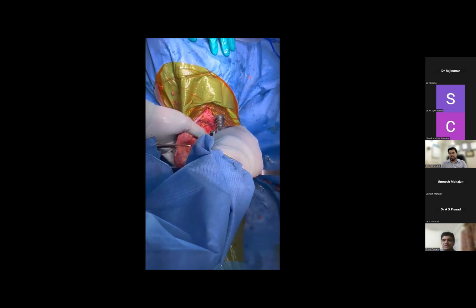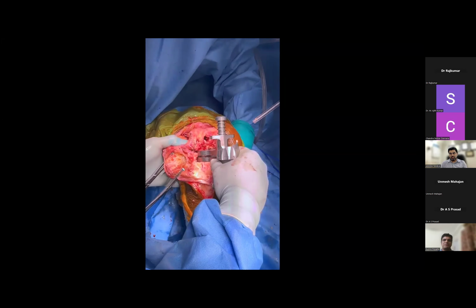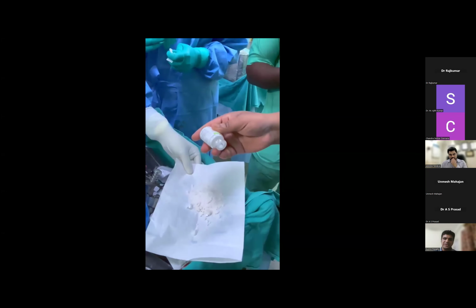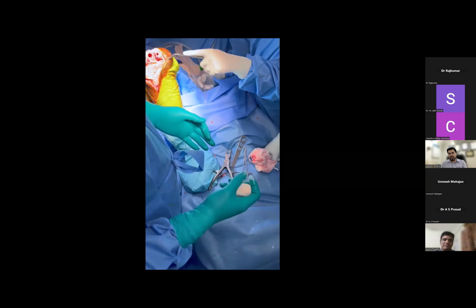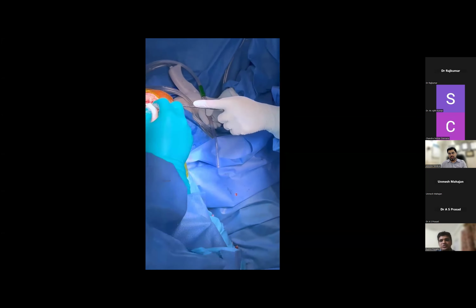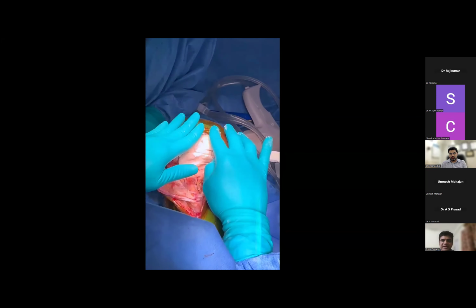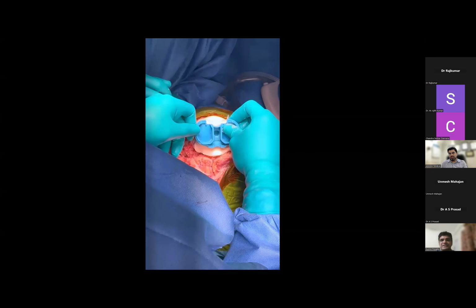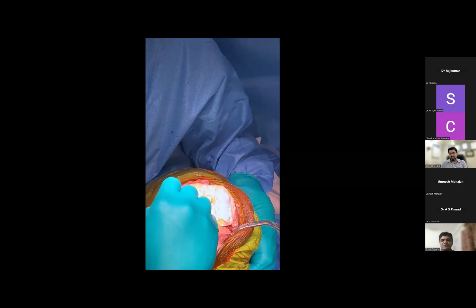So this is the extension gap. Here it was found to be 13 mm, and in flexion also we noticed that it is 13 mm. So probably it will be a well-balanced spacer that we are going to make. Then you should redrape and add vancomycin to the bone cement. We normally use 4 gram of vancomycin to 40 gram of bone cement, and normally 2 packs of bone cement are minimally required. We prepare one stem for the femoral side, and over that we put the bone cement in the doughy phase. And you need to shape it using a tibial insert so that the medial cam and post of both the tibial and the femoral sides will match there.